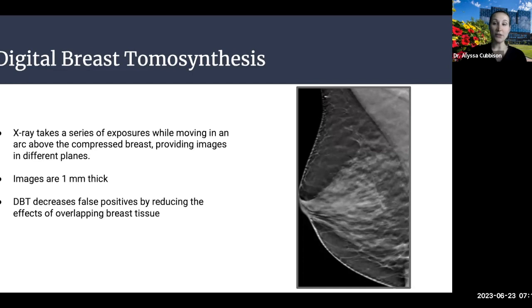But on the other side, and potentially more significant, we're also catching more cancers utilizing tomosynthesis. So it serves some pretty important purposes for us, not without its drawbacks. Just like anything, there's more radiation and more time. There is an added cost in many instances, but in general, it's been a really helpful diagnostic tool.